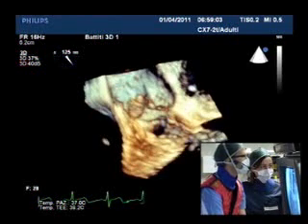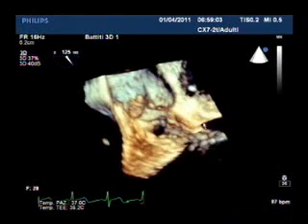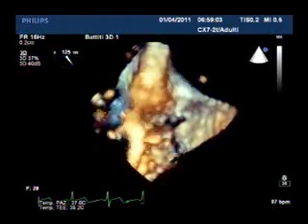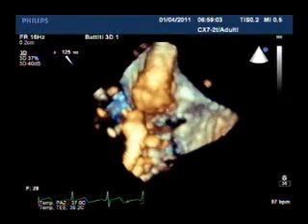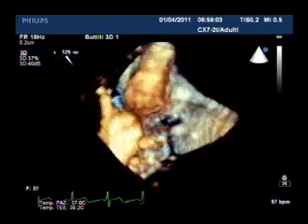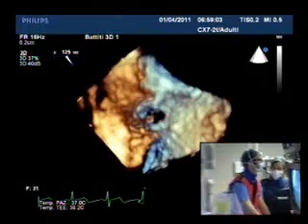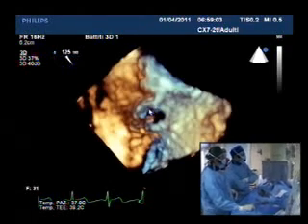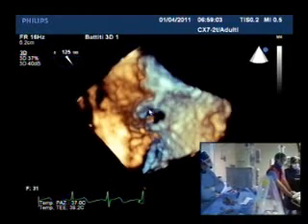And I can show you in a moment the aortic root. You can see it very nicely here, and that's the VSD below, and there's quite a significant gap between the VSD and the aorta. While if you move on the other side, you can see the VSD here and the tricuspid valve. Okay, so that's good. We did some measurements, and the measurements are about 8 millimeters. As you can see, the VSD is circular in shape.